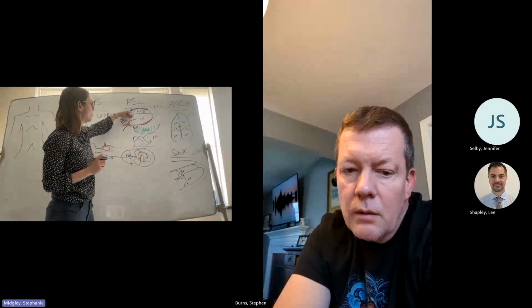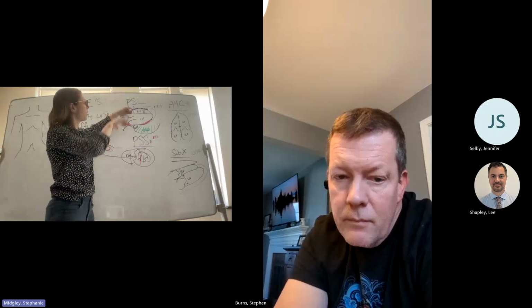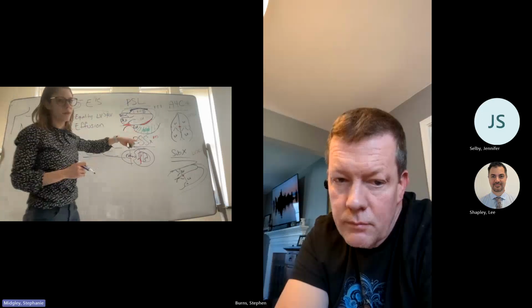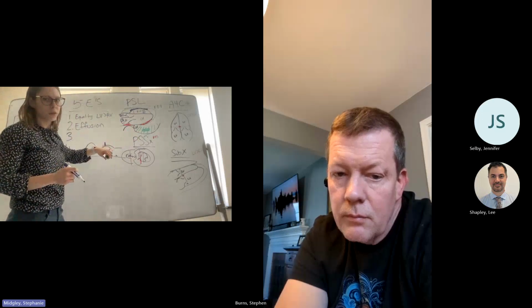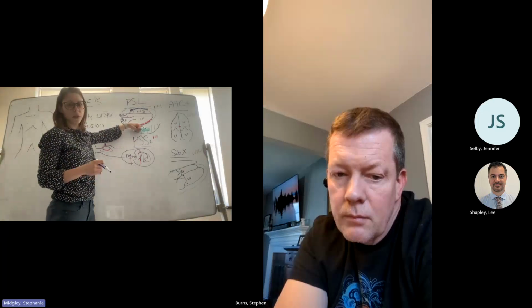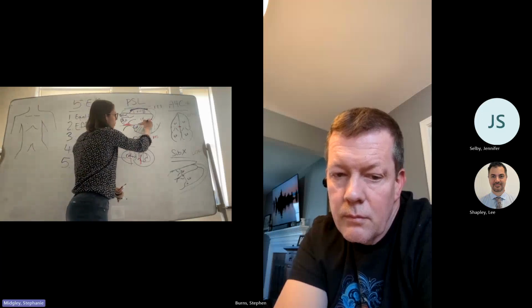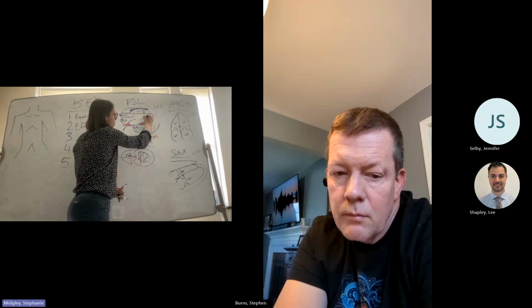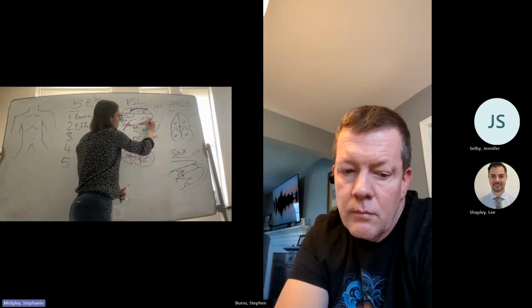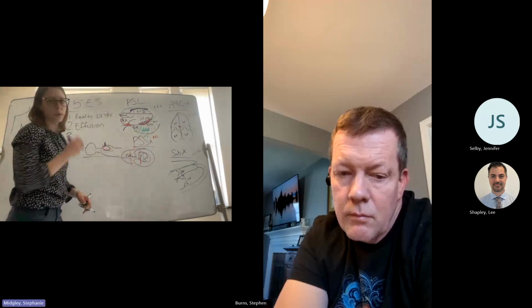So if you see fluid or something that looks like fluid anteriorly, at the top of the screen, but nothing at the bottom of the screen, I'm going to really start thinking that's probably a fat pad and not a pericardial effusion. But if I see something down here that's fluid, anechoic, so it's going to be black, in between my myocardium, my muscle, there's my myocardium, and this is my pericardium. So it's going to be black, it's going to be dependent, and in between those two structures.